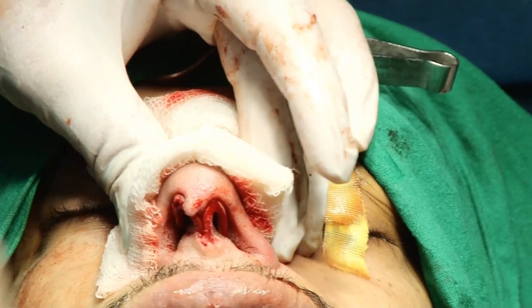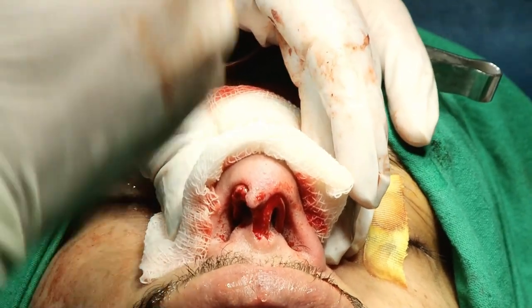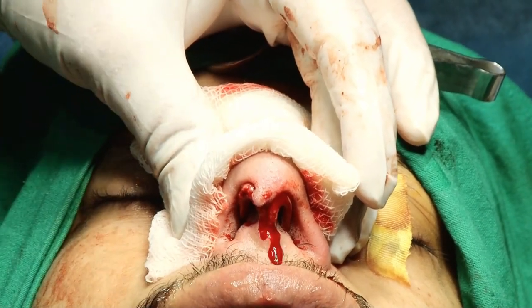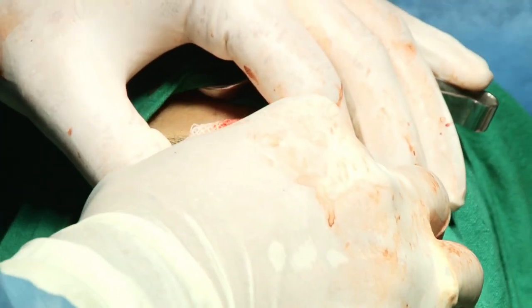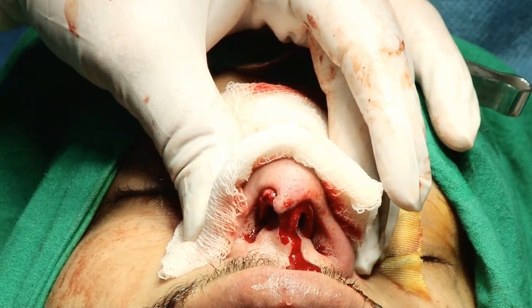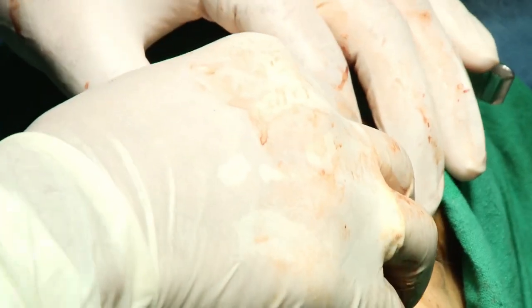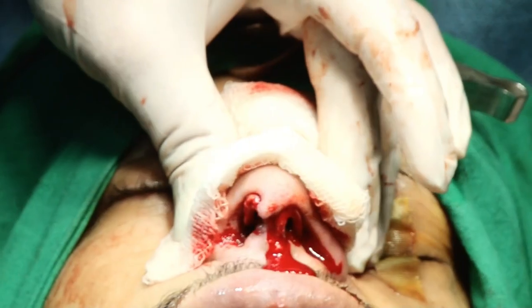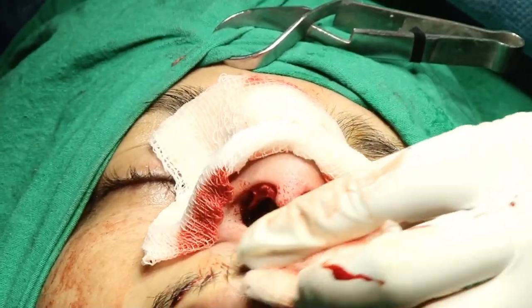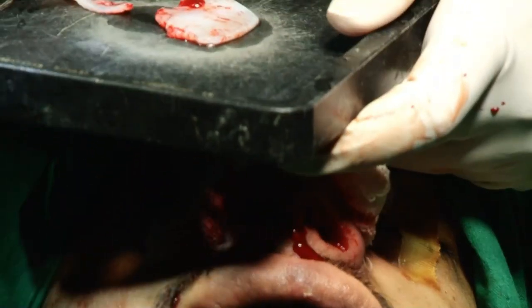In this patient, the deviation is mostly in the septum. On the right side there is a little bit of a bump on the bony part, which we rasp, and it is a little bit overwide, so we just narrow it a little. If in this patient you do a paramedian osteotomy unnecessarily, you will make your bony part more narrow. So the important thing is that first you analyze what your patient needs. This is the graft material that we harvested from the patient.